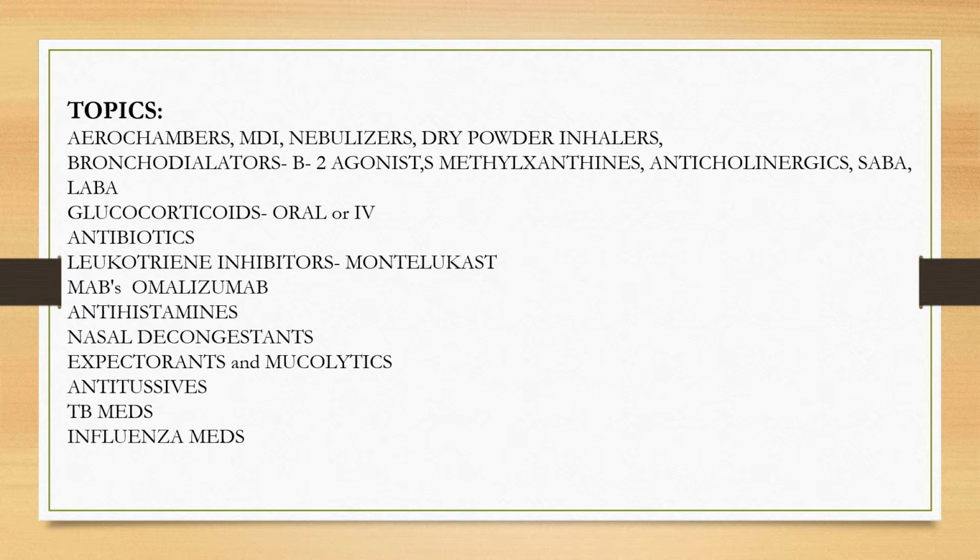So how does that help? Well, the patient doesn't have to time the sequence of when they press the MDI and when they inhale. Okay, because that can be really difficult for patients. So it just allows more of the medication to be deposited into the lungs.